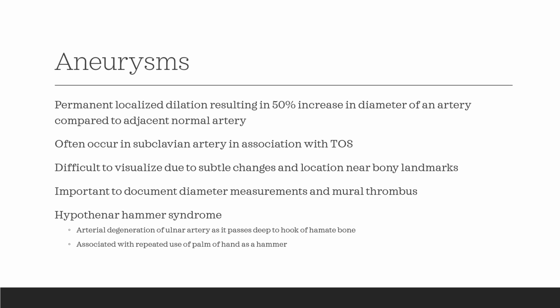When we're documenting an aneurysm, we are going to be measuring the proximal diameter, the widest area diameter, the distal diameter, and then the length of the aneurysm itself. We also want to make sure to add color flow here, and we expect to see a turbulent region within the aneurysm. If we do not see that turbulence filling the whole aneurysm, we will be concerned that there could be a clot reducing the lumen, making it almost look normal.